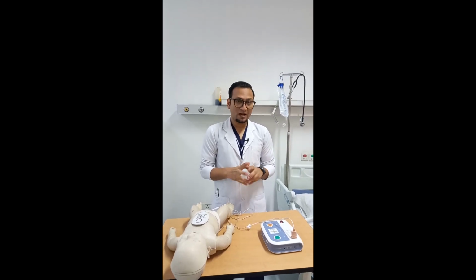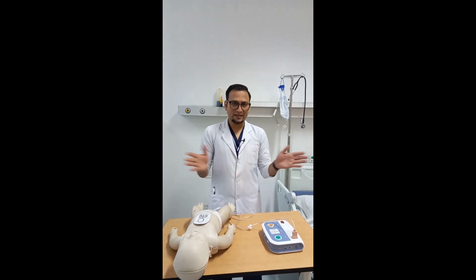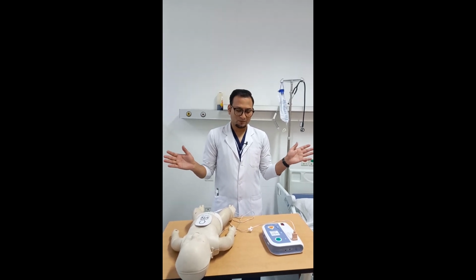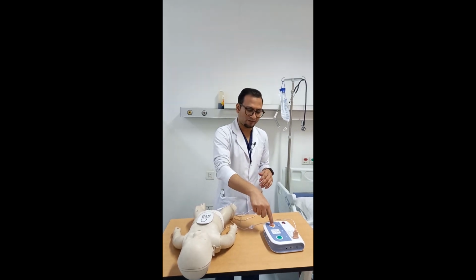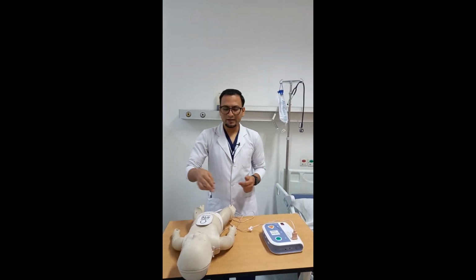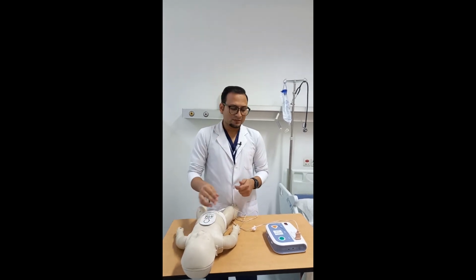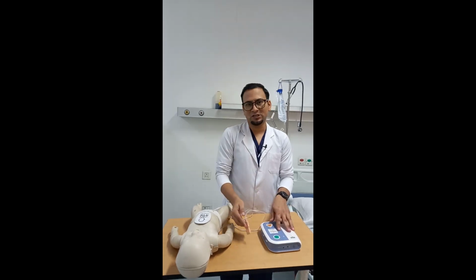Shock advised. Now shock is advised. Charging. Stay clear of patient. Deliver shock now. Now, press the orange button. Now we deliver the shock by pressing this orange button. Shock delivered. Begin CPR. Now the shock is delivered and we can begin with CPR. So this was the functioning of the AED machine, and this is how the AED machine works.